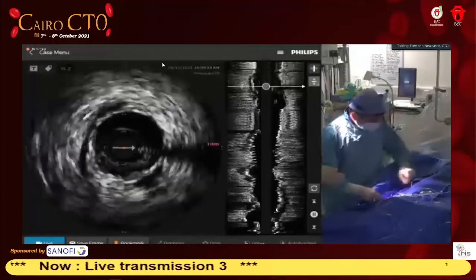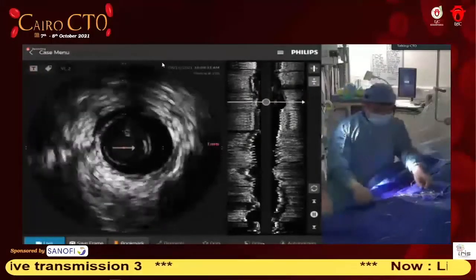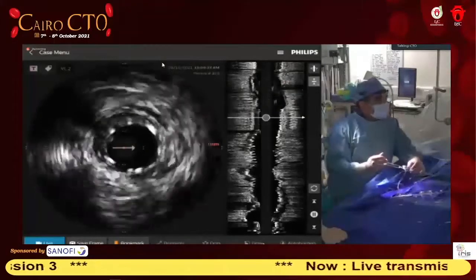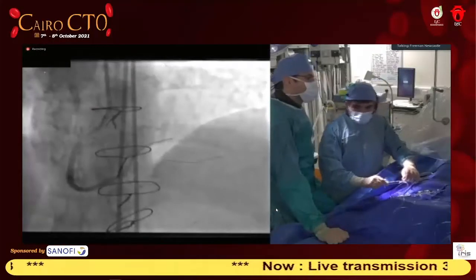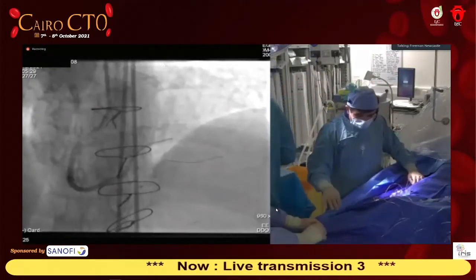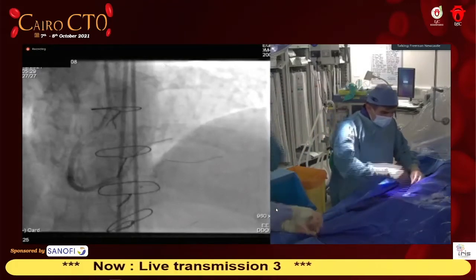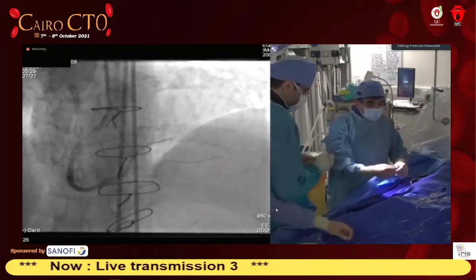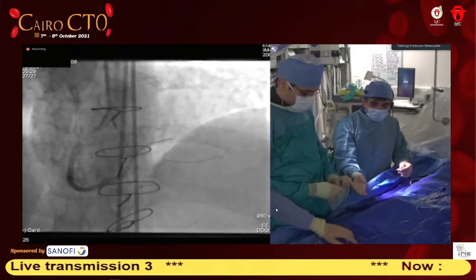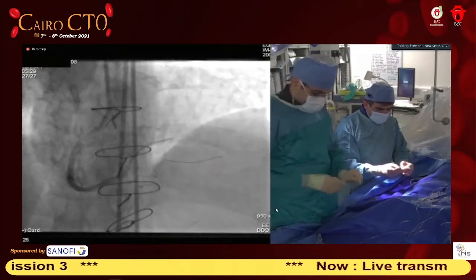What we will do. Who would put a distal stent, a fourth stent? Majority wants to put a stent, Muhannad. What do you think? I am going to put a stent, to be honest. Let's have the 2.5 balloon first. I won't leave it because the distal runoff is what determines your long-term, even short-term outcome of the stent. If you don't have a TIMI-3 flow, especially when you have long segment stented, you know that it's going to be a problem, especially when you have a vein graft.